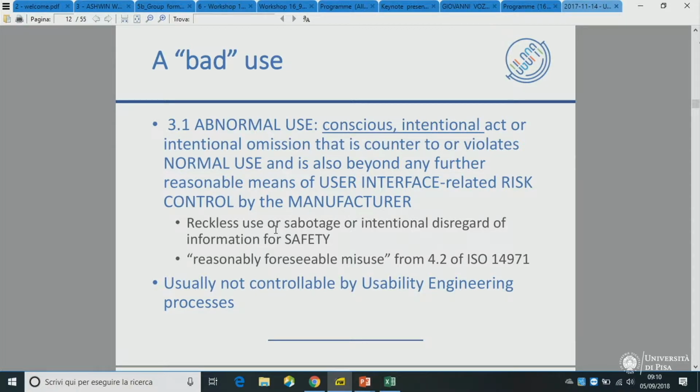I have seen nurses cutting the end of a nasogastric tube to avoid having a check valve at the end, having just the open tube, and using this for washing the inside of the stomach of the patient, with 2 different tubes. One goes in and the other one goes out. They have a nice name for this procedure. It's like a pressure release procedure. It is a horrible thing to do. And there are so many examples.